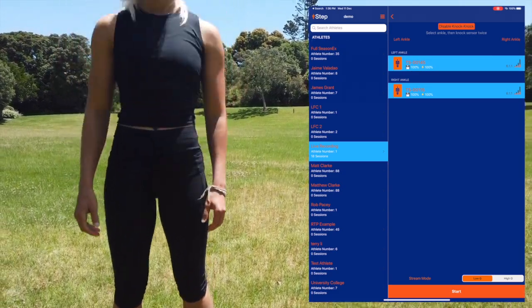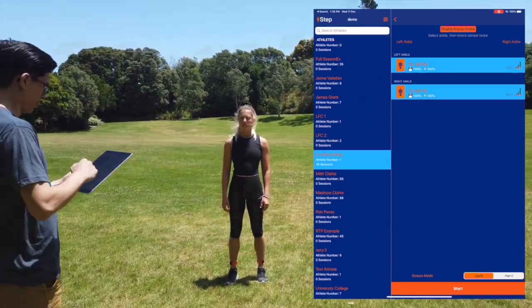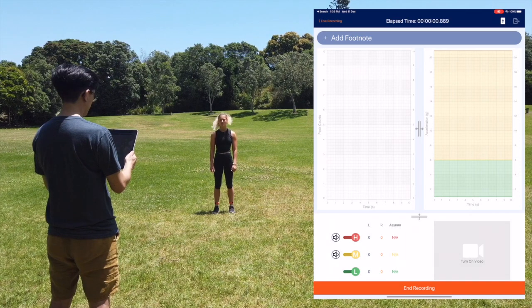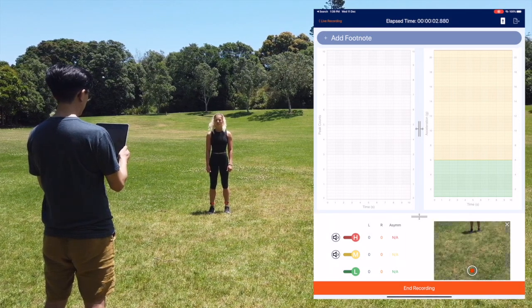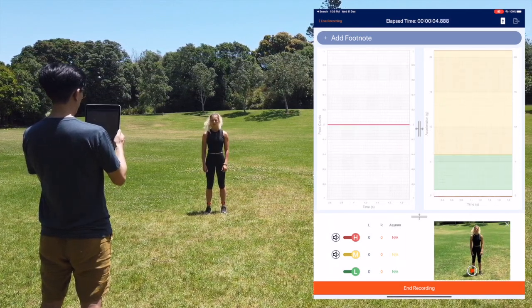Select whether you would like to view data from the Low-G or High-G accelerometer, then press Start. Once your session has started, enable video by tapping Turn On Video.